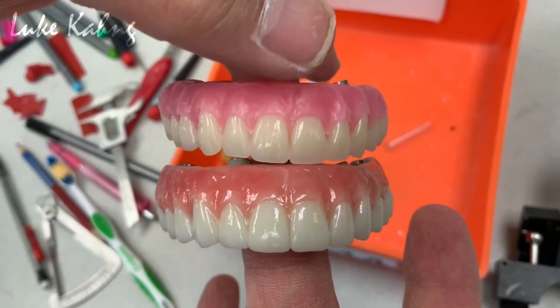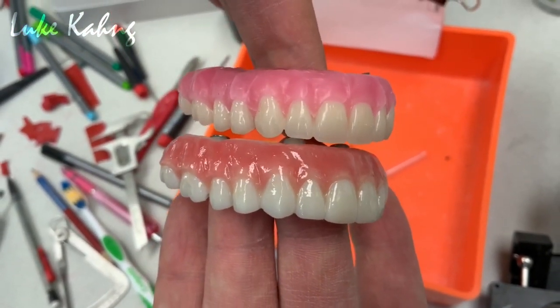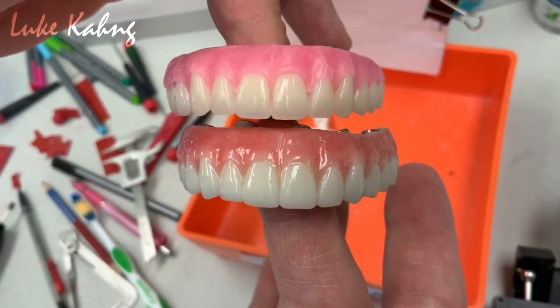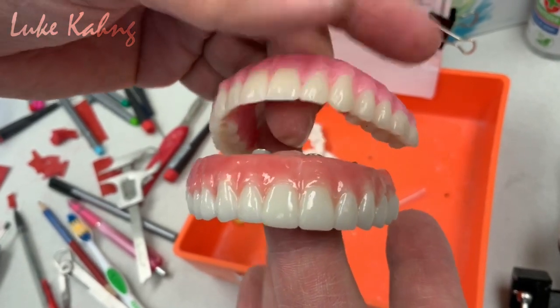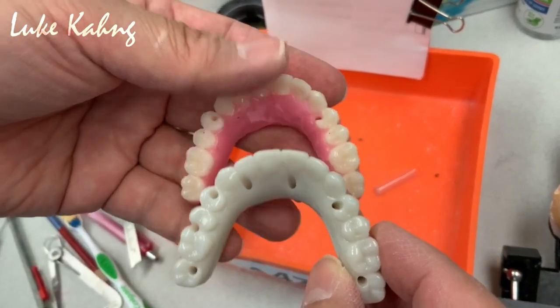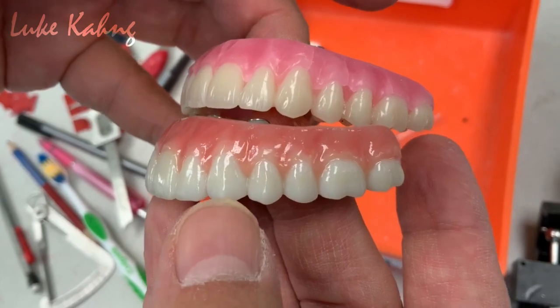Doctor sent me the beautiful setup wax try-in, and then we made the prototypes, so PMMA, which is reprinted, and they utilize more aesthetics with a gradient composite and optic glaze on top of that. So it's our job. It's good compared to check the occlusion contact. This is good. The right side view. It's nice.